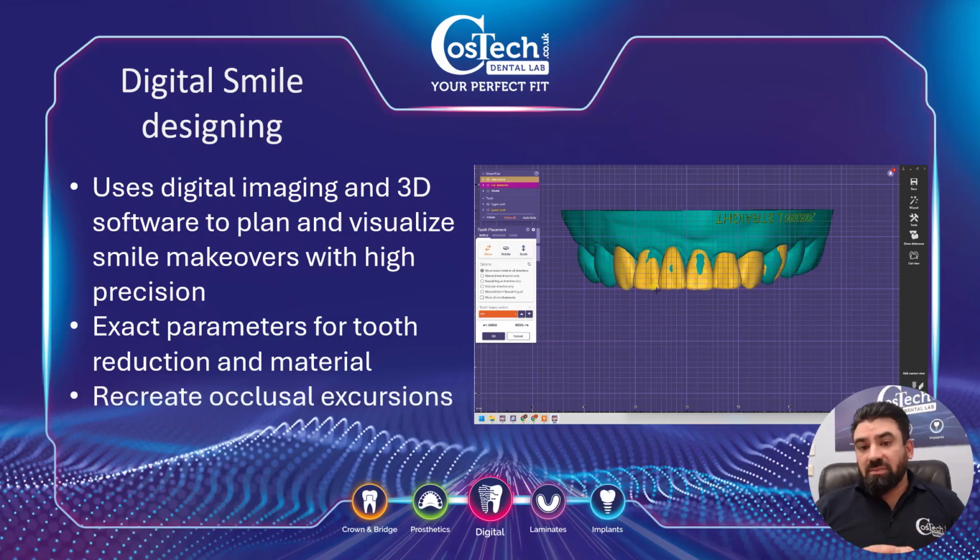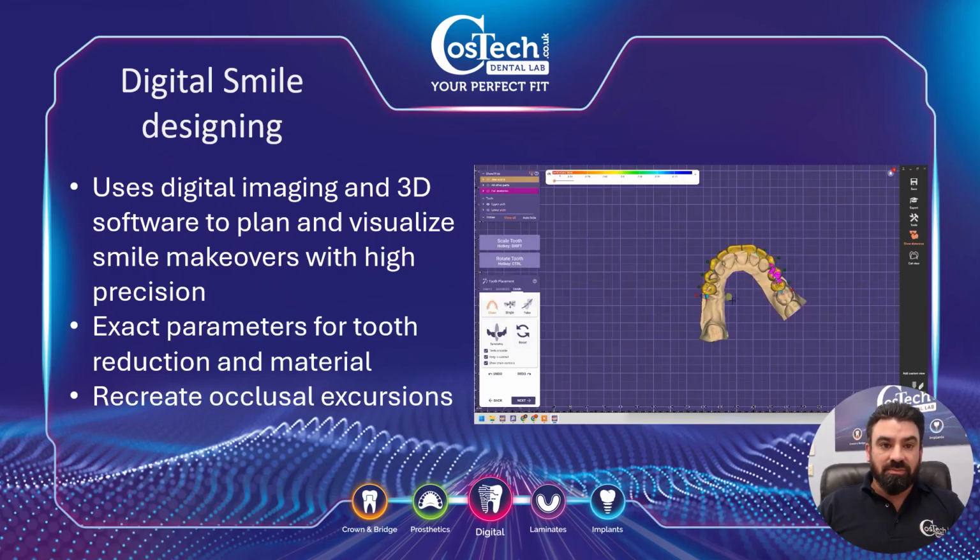With the CAD system, it's absolutely brilliant if you're using an intraoral scanner and you take the bite, we can very, very accurately recreate the actual bite and the excursions. So while we're designing it, we can recreate that on the system, and then it can tell us if it's going to be damaging to any sort of tooth material that we'll be doing, or if we say, for example, we're going for Emax and it's going too thin, the system will actually put up a warning so we can work around it and come up with other solutions.